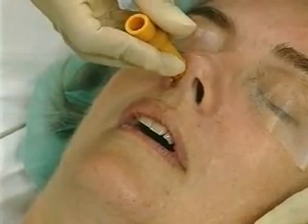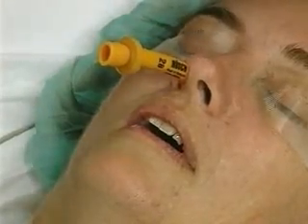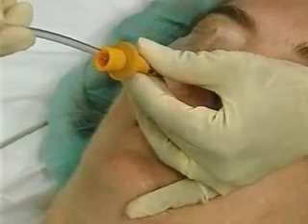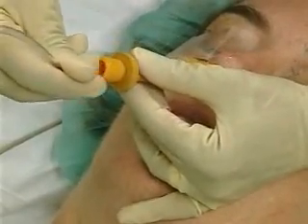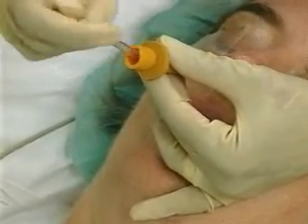If the airway still does not pass, a narrower tube should be used. Once inserted, withdraw the tube two centimeters and pass a small suction catheter through it, then push the airway forward using the catheter as a guide. If still unsuccessful, the nares can be redilated or the other nares can be prepared.